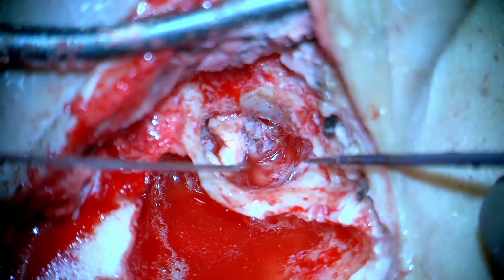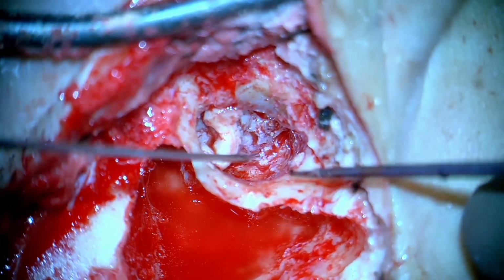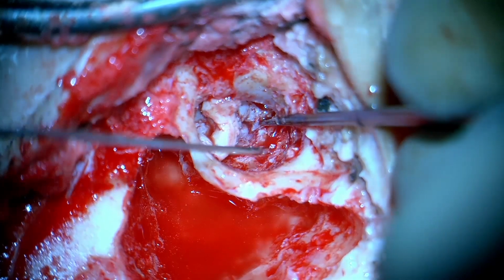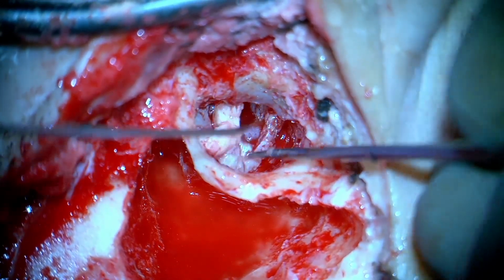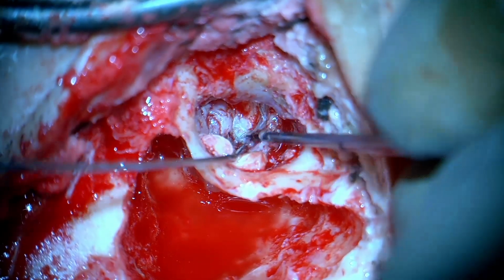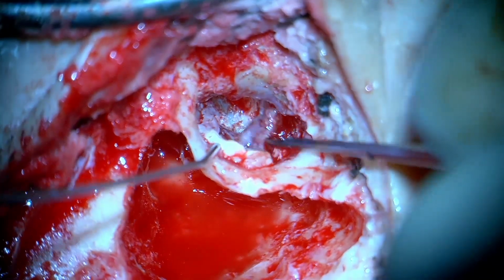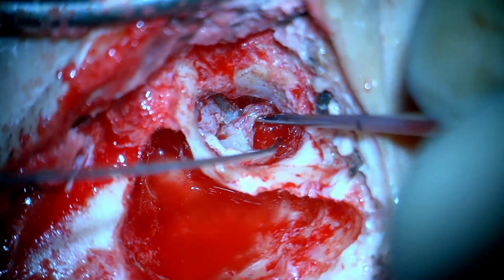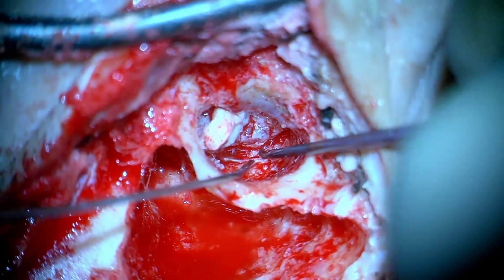Time and again in these patients, one must put the flap back, reorient, and create a mental roadmap as to the possible locations of the annulus, the chorda tympani, and the facial nerve, because we are operating in distorted anatomy where the canal wall is grossly expanded and eroded from anterior to posterior, thus compromising landmarks.